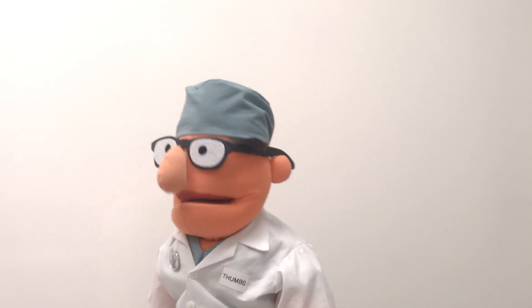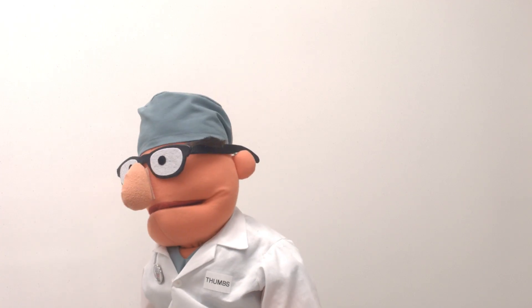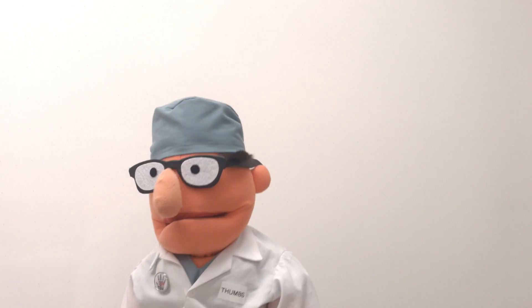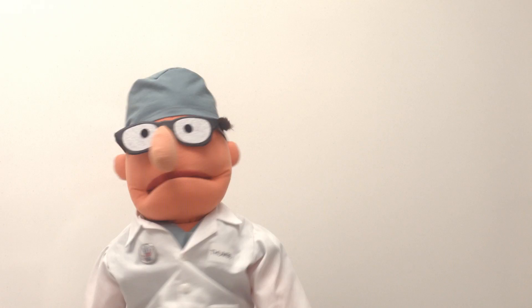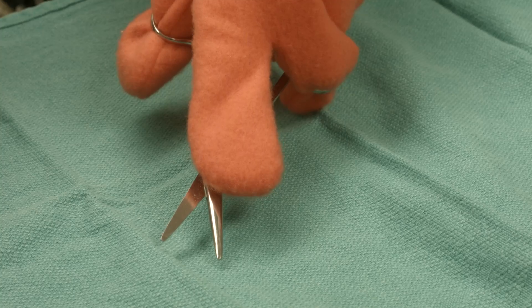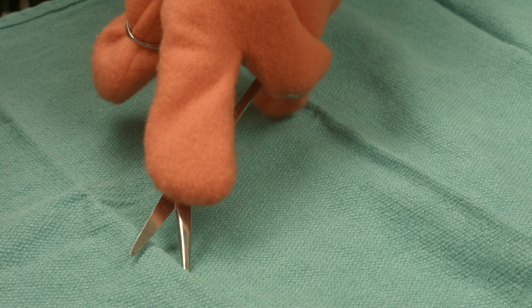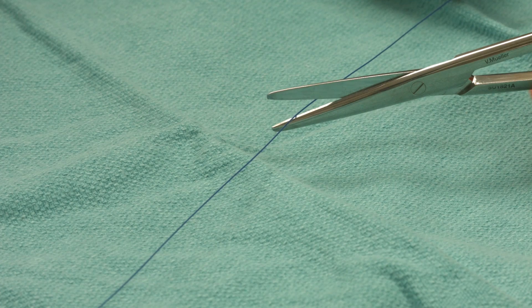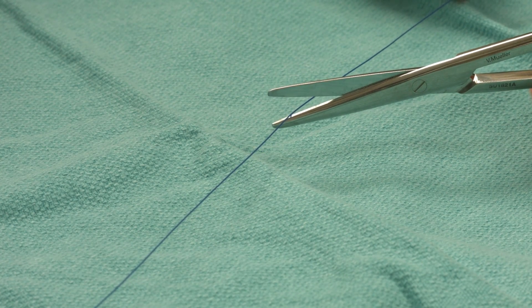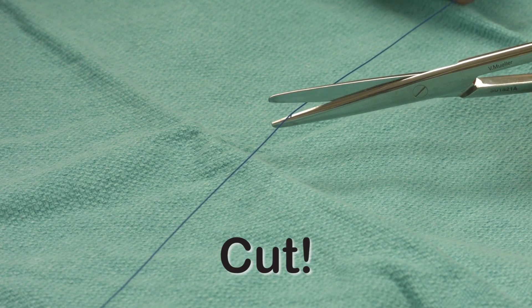Sometimes the nurse will notice before you do, and will put a pair of suture scissors in your hand. When the surgeon is ready, they will gently say 'cut,' and that's your cue to go. You can steady the scissors by using your index finger, or by resting one hand on the other — that will stop your hand shaking. The surgeon will be holding the suture up ready to be cut, so put the tip of the scissor right on the suture and snip!